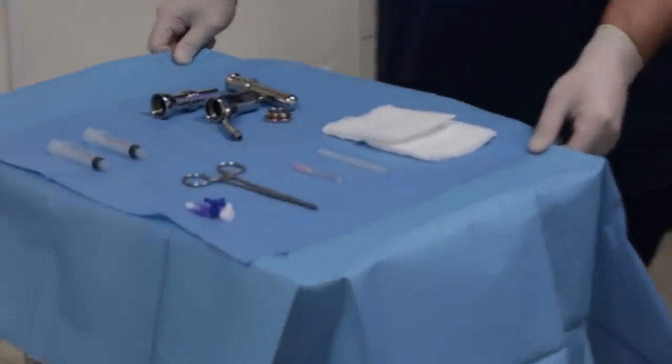The aim of this video is to show a treatment of second-degree hemorrhoids with foam sclerotherapy with the support of a video anoscope.